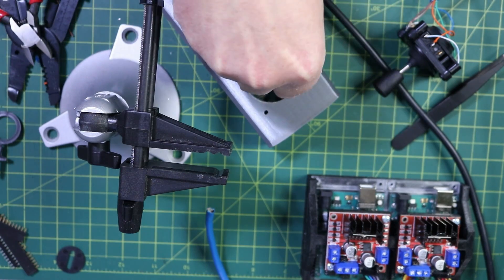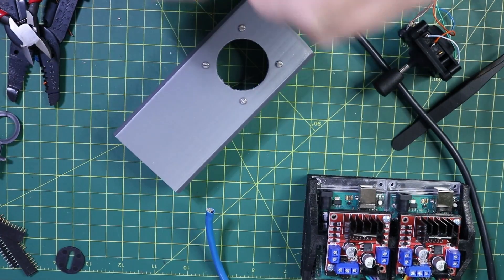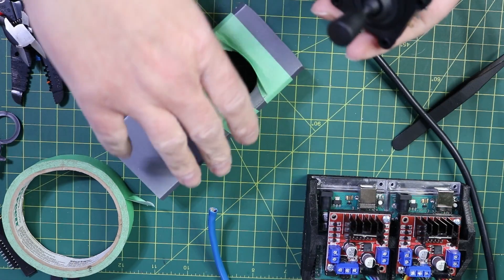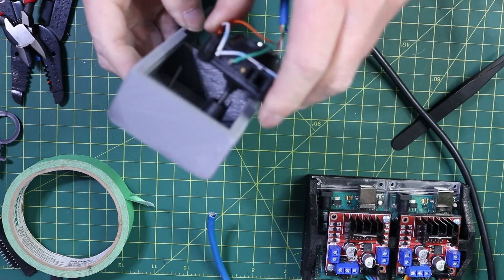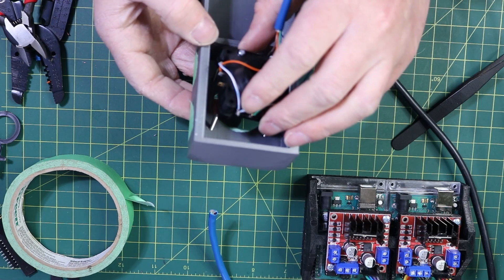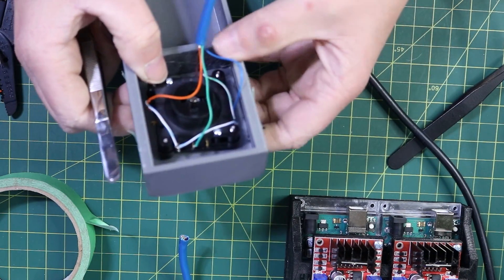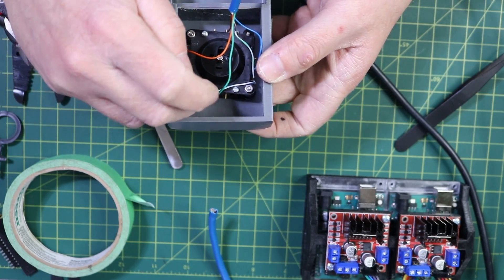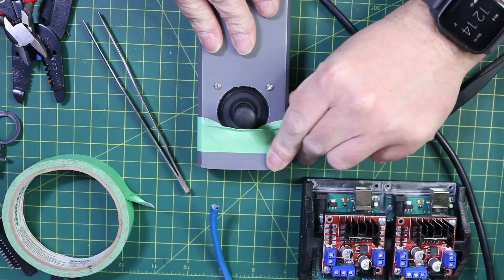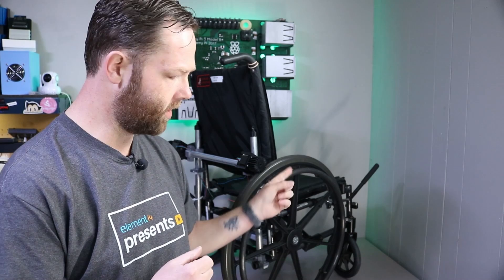We're going to put our screws in the hole. The joystick housing snaps together — we flip it over and put it on in, then get the nuts threaded on the bottom. Tighten them up — you don't need to be Hercules on these ones. Now that we have our joystick wired up, we can get it mounted onto the wheelchair.